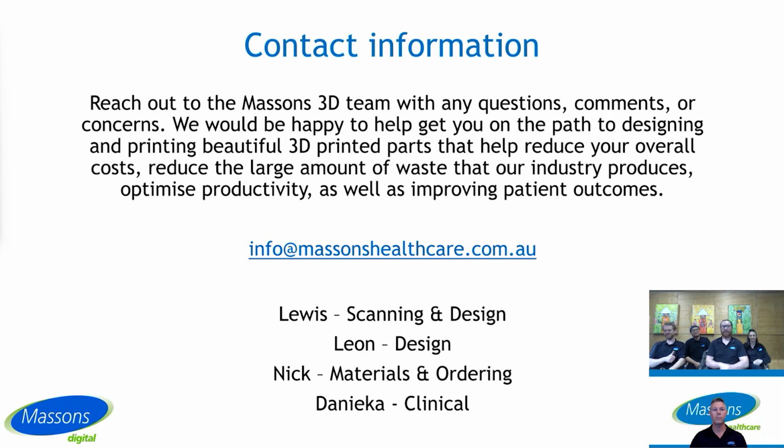Yeah, I thought TechMed sells some scanning plates, which are adjustable in angle. You have the person sitting in the chair and then you can take a semi-weight bearing scan with the body scan or the Omega scanner, which is a Creaform scanner. TechMed do sell some scanning plates which can be used with those two scanners. So we can send you some more information on those plates.